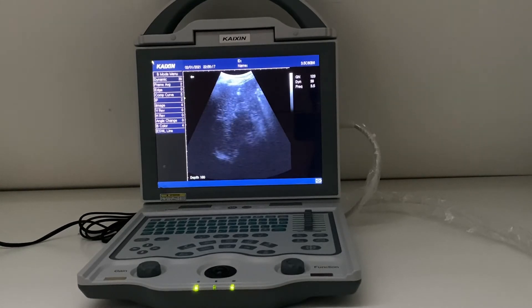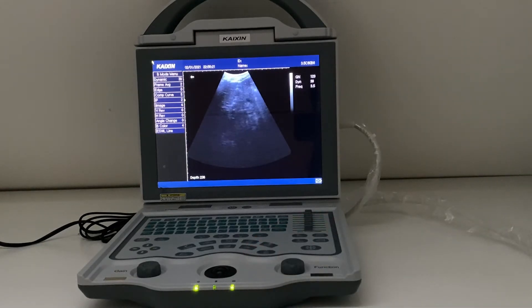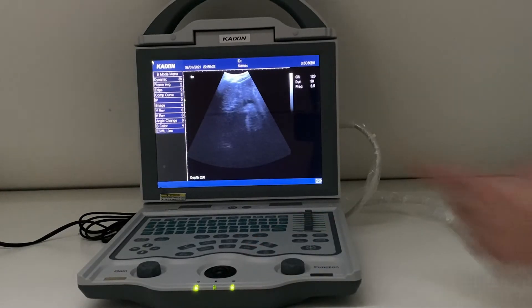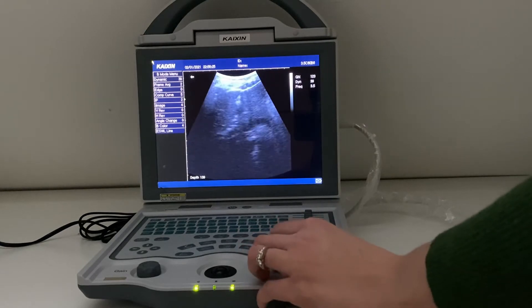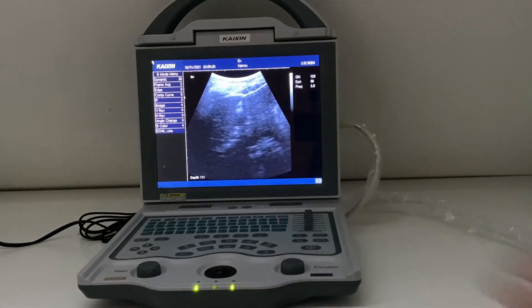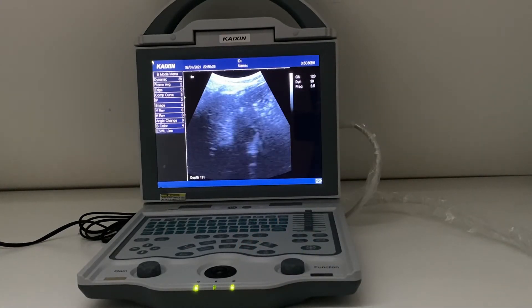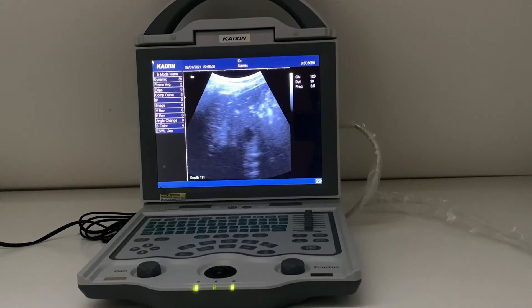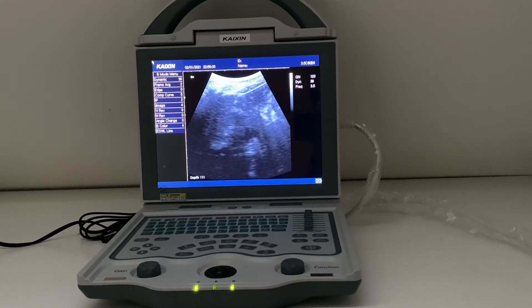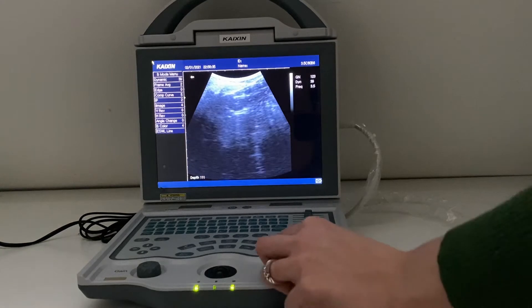The same principle applies with the gestation sac. You might start at a greater depth, but once you've located that sac and you can see it at the top, you're going to want to reduce your depth a lot so that the sac is filling up as much of the imaging area as possible. You don't want tiny little sacs stuck at the top of your screen with a lot of wasted space.